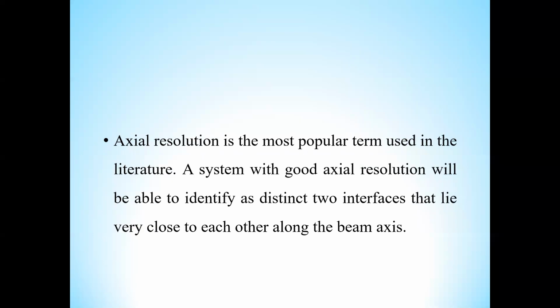Okay, so by increasing frequency, we can decrease the length of a pulse. And while using a pulse with a short length, we have better axial resolution.